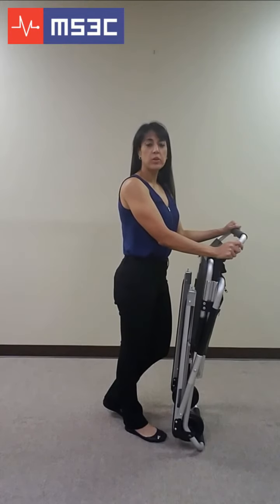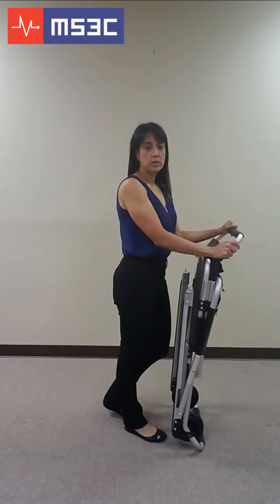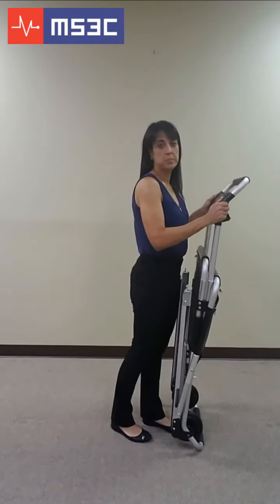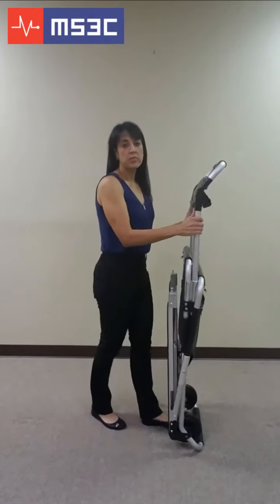These next steps will prepare the unit for passenger loading and transport. To unfold the chair, extend the telescoping control bar until it locks into place. Next, unfold the chair.